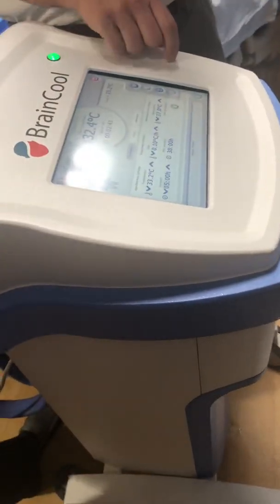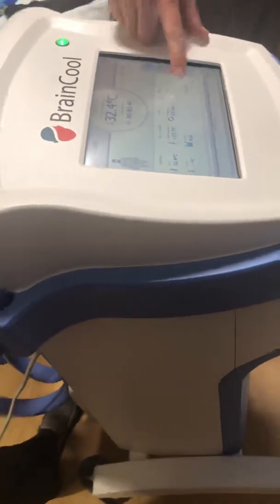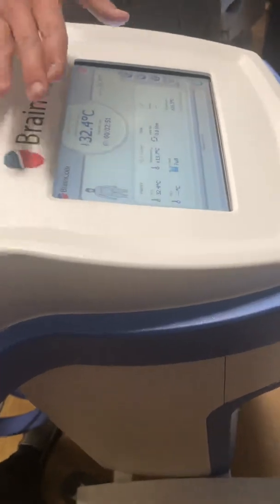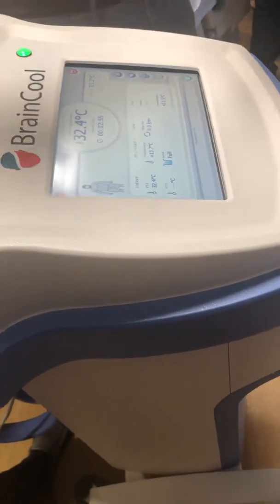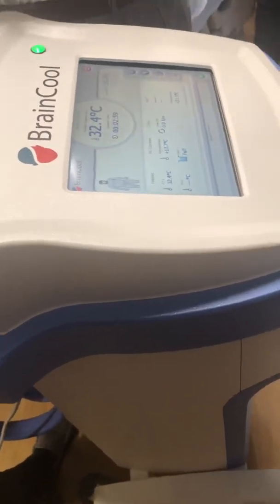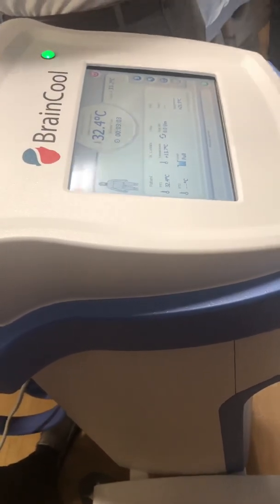Okay, and then the pad power. Yeah, so your pad power is going to show up. It refreshes every 5 minutes. Okay, so when you see the tank temperature getting cold and that pad power increasing, your patient is fighting the therapy. Right? So cold water temperature means they're fighting it.